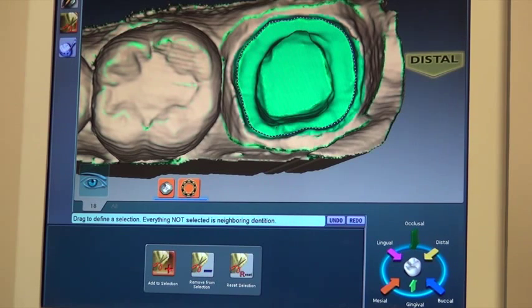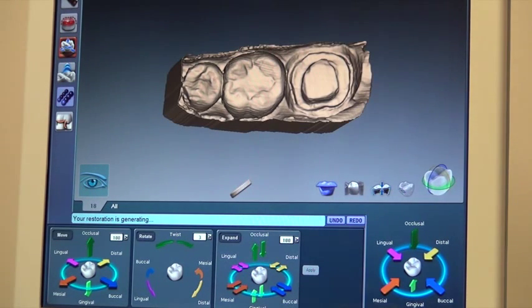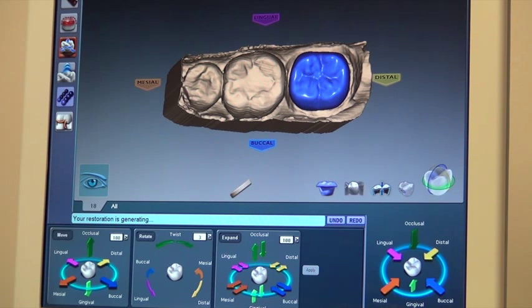The next step is going to the design phase. When I hit design, we'll see what the computer does — it will incorporate the bite registration material and help us design the crown. It punches it in and puts a tooth shape to that area. Now, that's not perfect and not ideal yet, but it places a sample there so we can see what we need to change and modify to make it perfect.